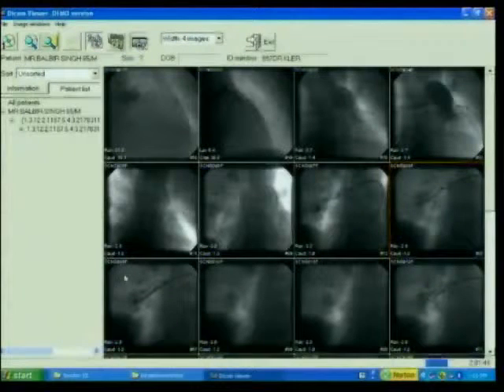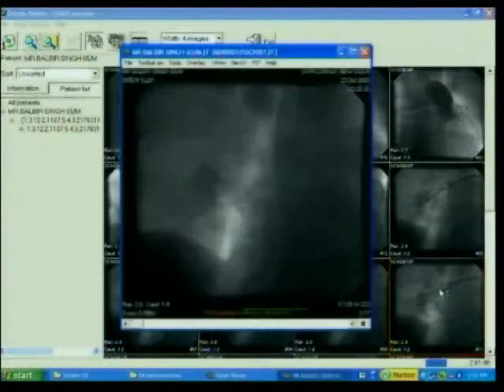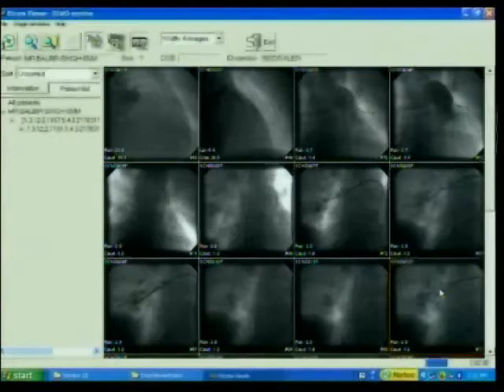After that we leave a pigtail catheter and inject urokinase or TPA through that, and maybe after about 6 to 12 hours of lysis we get very good angiograms with good clot lysis and a good saturation. This is in the right main pulmonary artery, and then we go to the left side, we do the left pulmonary artery, and then we do the segmental pulmonary arteries. You can see that the clot burden has decreased and the patient's saturation improves on the table. Next.